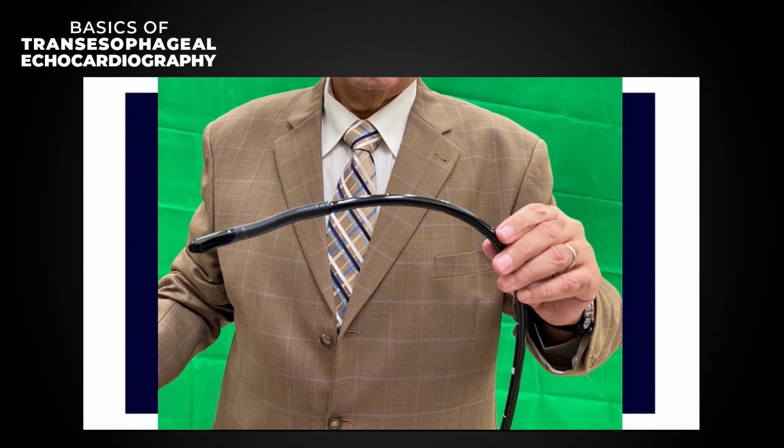Sometimes we put the probe into the esophagus and find that it is not going easily. Don't push, because there might be a diverticulum in the esophagus, and the tip of the probe might be trapped in it. If you push, you might perforate the diverticulum, and the patient might suffer fatal mediastinitis.